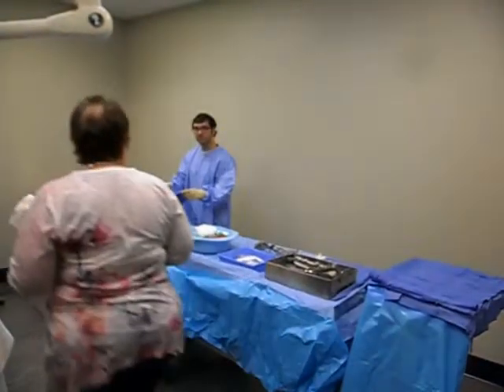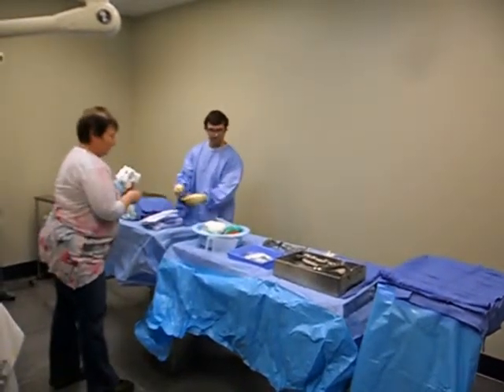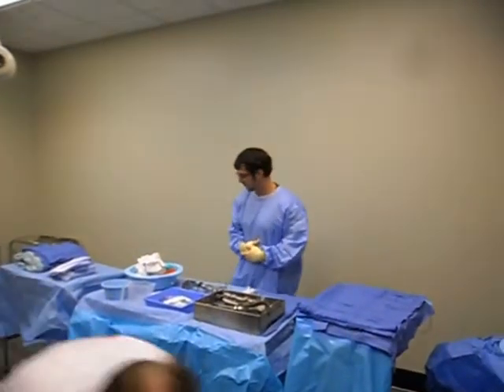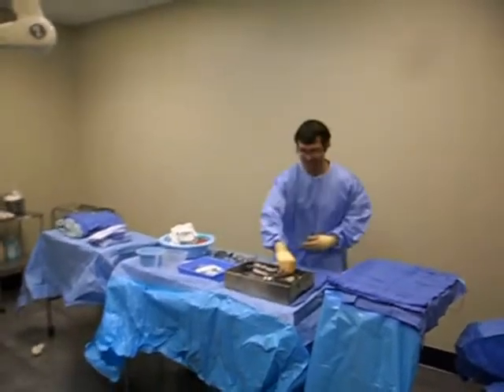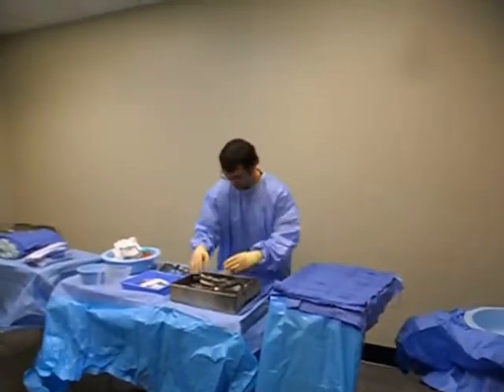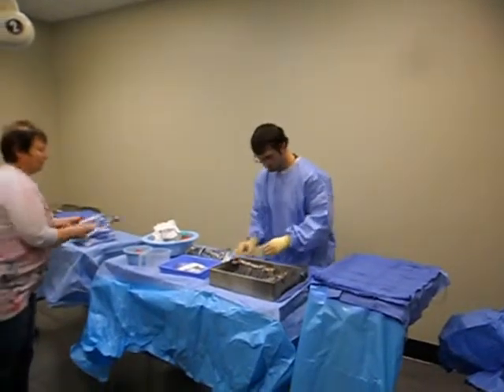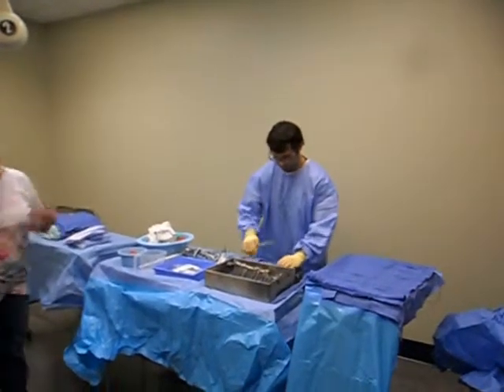Okay, you are missing a lot of things. So I would have to open up irrigation, I'd have to open up this, I'd have to open that. Lots. About 4 packs of laps, and you're missing a cautery. I did mention that though, at some point, so that's on the record. So I would have to flip all of this stuff. Cautery, light handles. Now, if you'd used a major pack, we'd have everything we need.